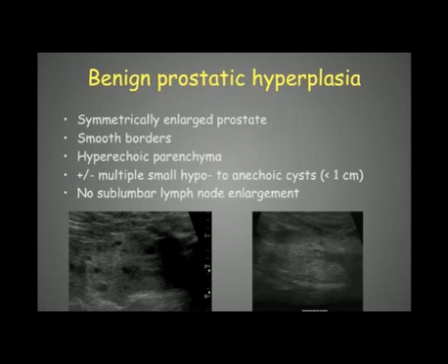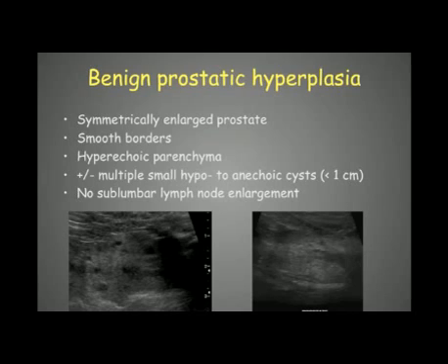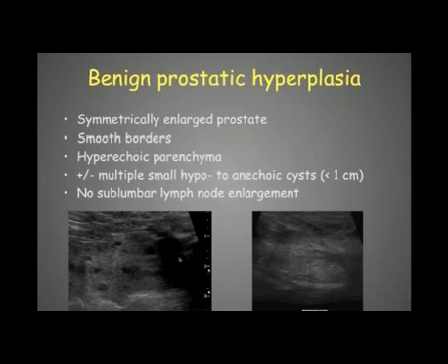Benign prostatic hyperplasia appears as a symmetrically enlarged prostate — it can become very large. The borders will remain smooth and the parenchyma will remain iso- to hypoechoic. In this example the parenchyma is quite hypoechoic and we see multiple small hypoechoic cysts within the parenchyma, generally measuring less than one centimeter.